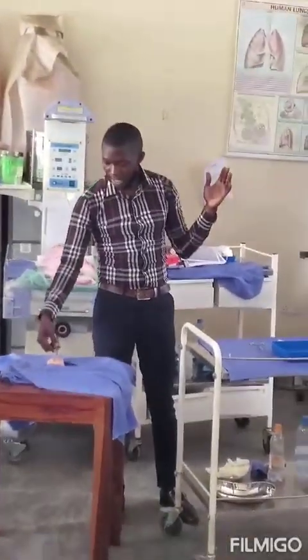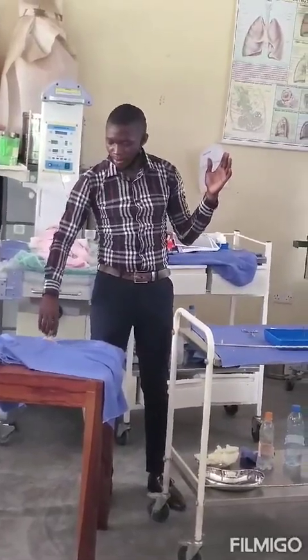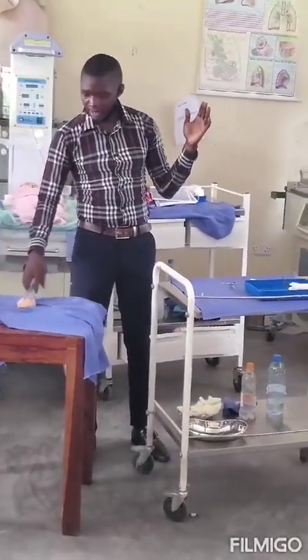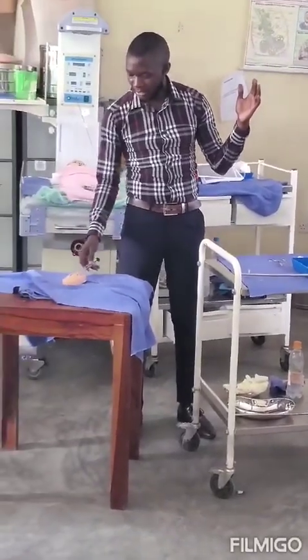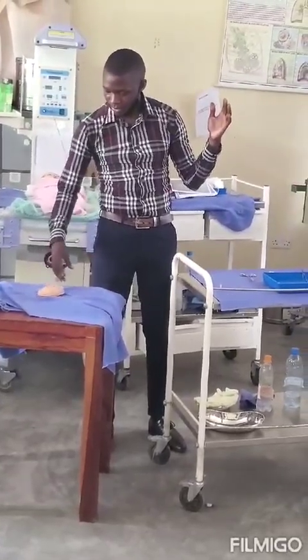So you will start from the edge on top like that. Once you go in, as you withdraw, you are pushing in the lignocaine. And once it's out, you go in the side. As you are pushing out, you are pushing in the drug. You go to the other side. As you are removing, you are pushing in the drug until you are able to give the whole wound.